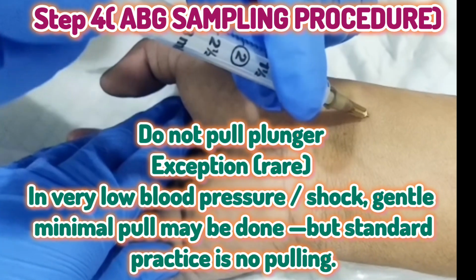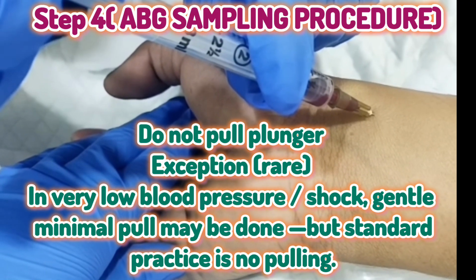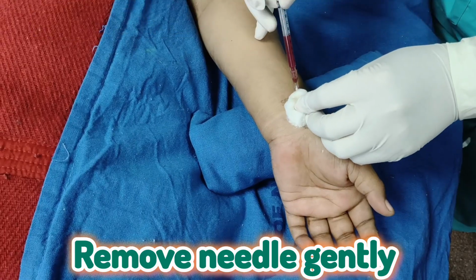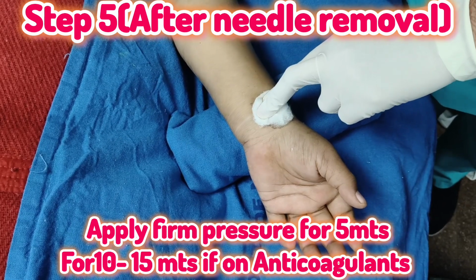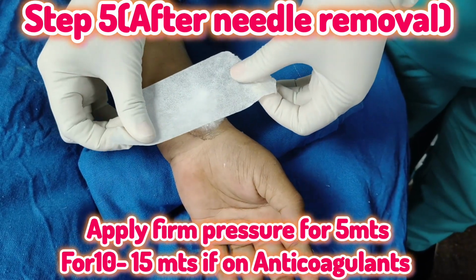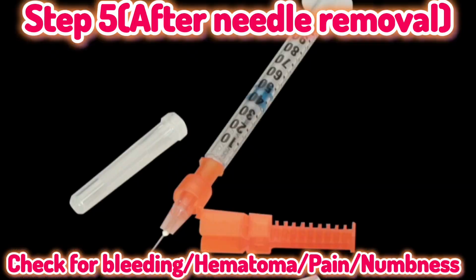Do not pull the plunger because arterial pressure will fill the syringe automatically. Collect 1 to 2 ml of blood. Remove the needle gently. Step 5. After needle removal, apply firm pressure for 5 minutes in normal patients and for 10 to 15 minutes for patients who are on anticoagulants. Check for bleeding, hematoma, pain or numbness.